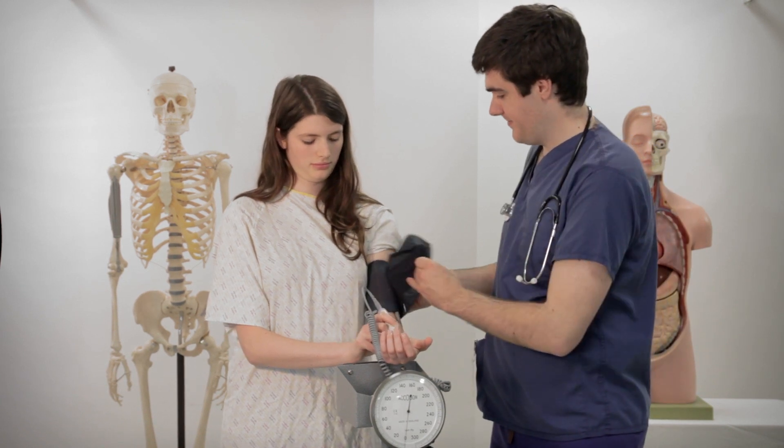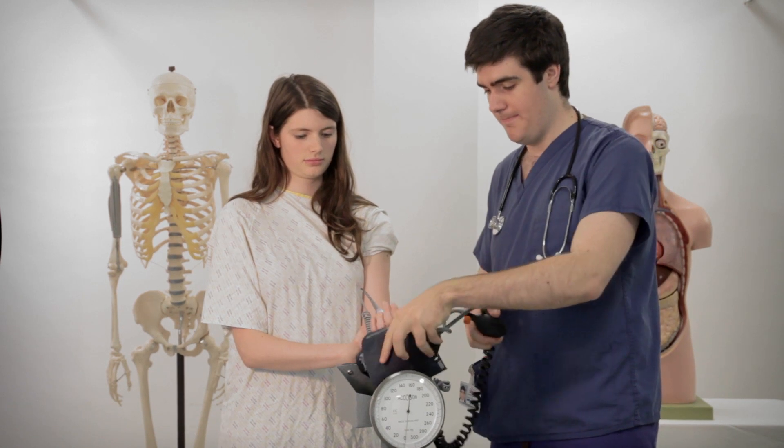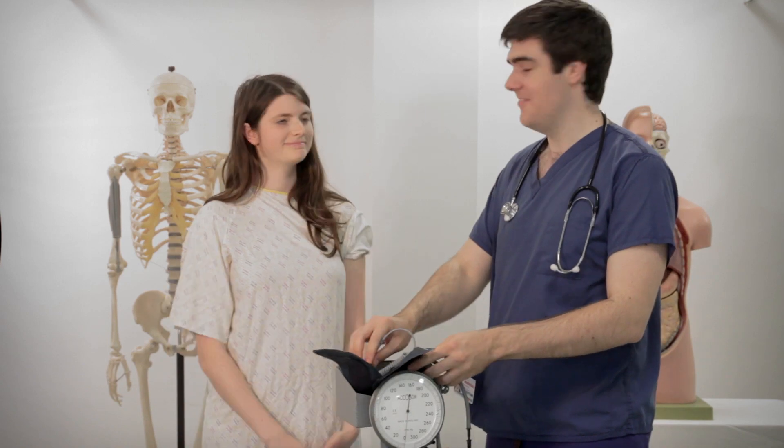I'll take the cuff off because it can be quite uncomfortable if you leave it on for a long period of time. And we'll just shut off the Doppler probe. That's great. Thanks very much Sophie.